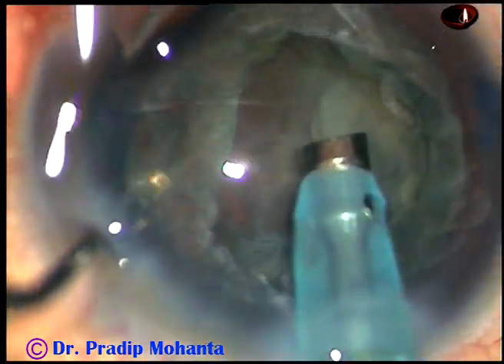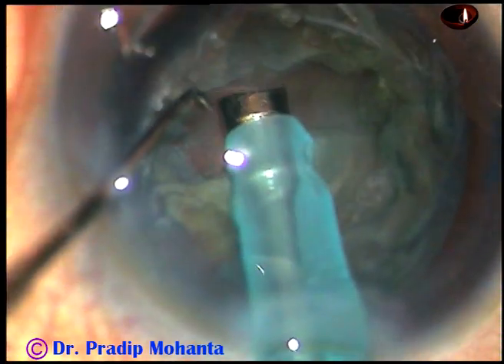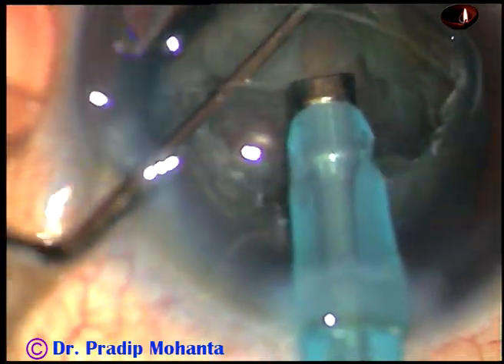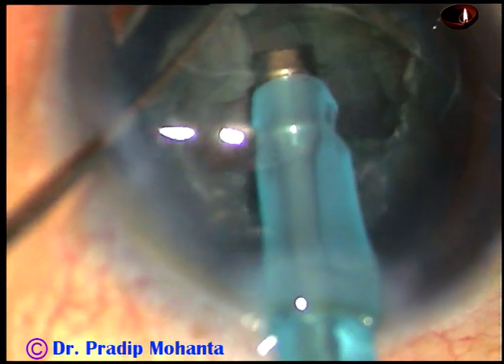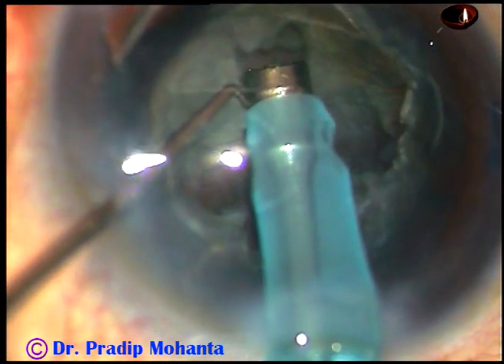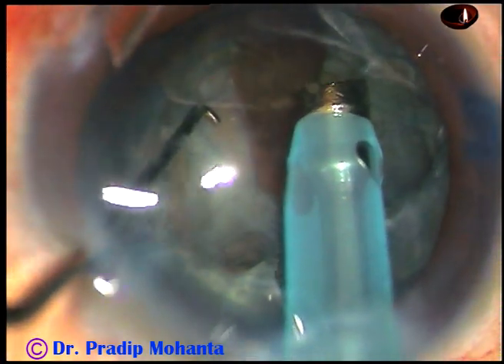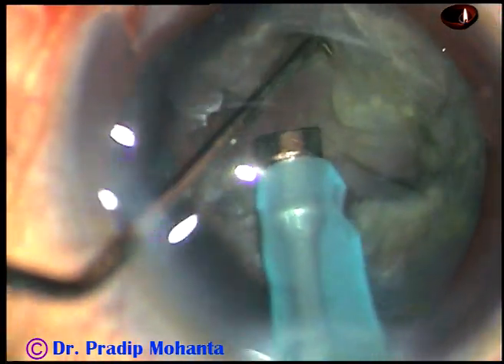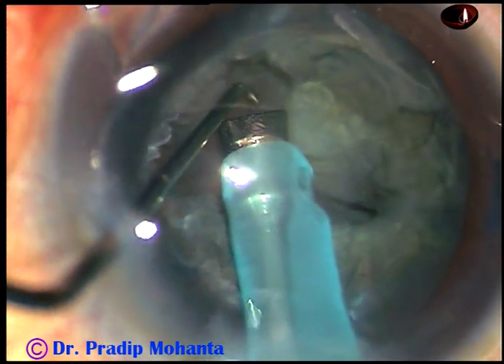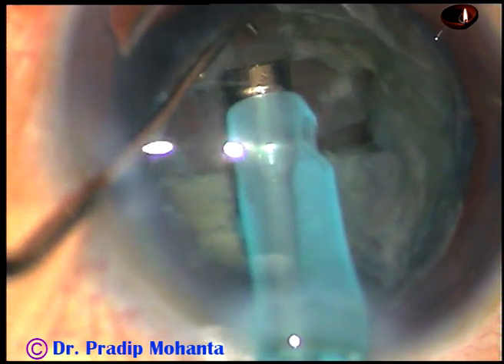This is the other side of the first trench. After the initial trench, I can see that it is not right at the center — one part of the nucleus is larger than the other part. In such cases we end up making three fragments. This is the first crack. Go at the floor and then apply opposite forces. At this time you can also sculpt if needed. And yes, we have made three fragments.